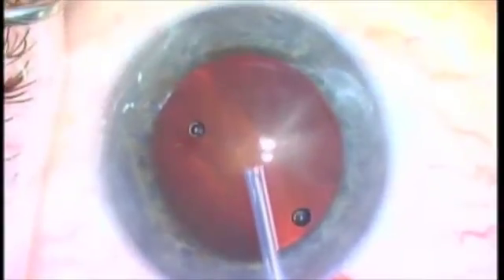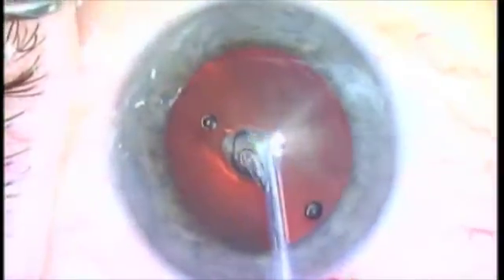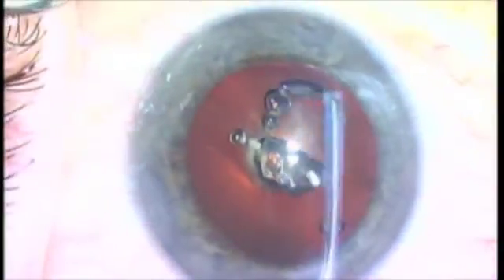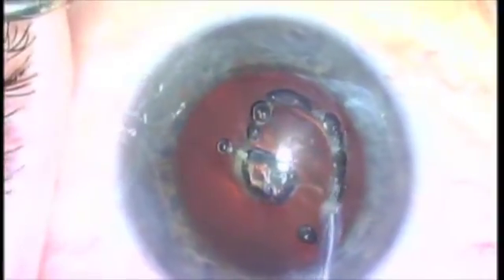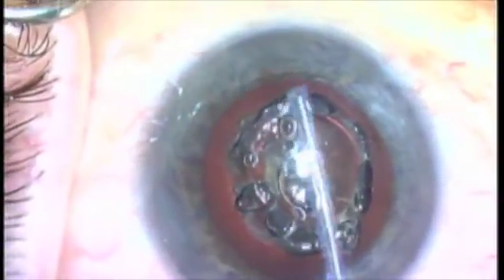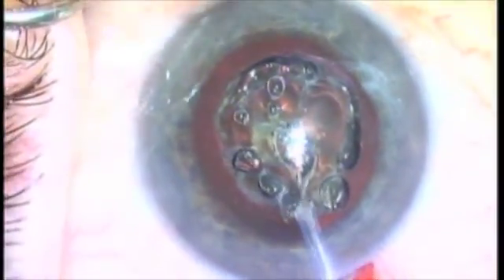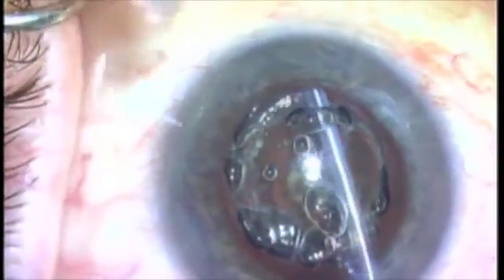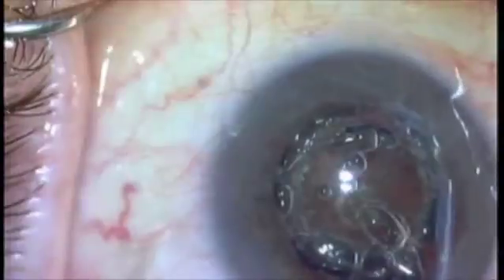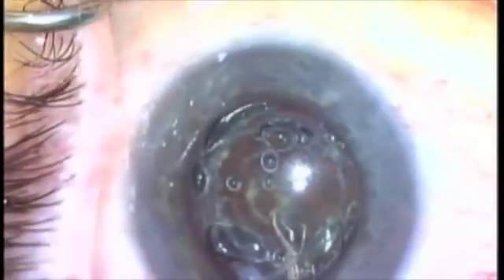Here we have another white cataract and I'm making a large capsulotomy. Listen, this is a terrific device — I use it in every case. Here I make a small capsulotomy, then just walk around, spiral around, and make you a beautiful, quick, easy, and perfect moderate-size capsulotomy. This puts you in complete control. Now I'm saying I want a bigger capsulotomy — fine, I'm just spiraling around the original capsulotomy. Isn't this a wonderful capability?